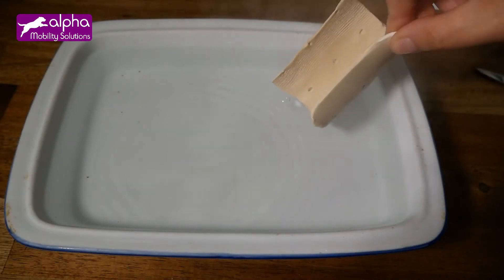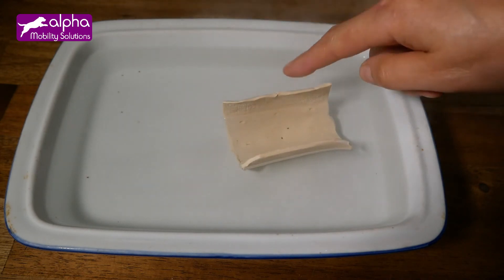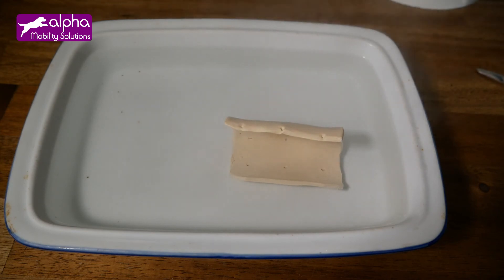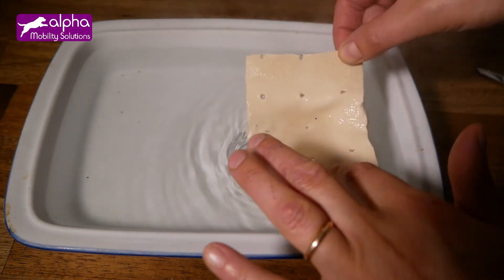The splints can be reheated and used again a few times. However, some areas may become thinner and stretch over time.